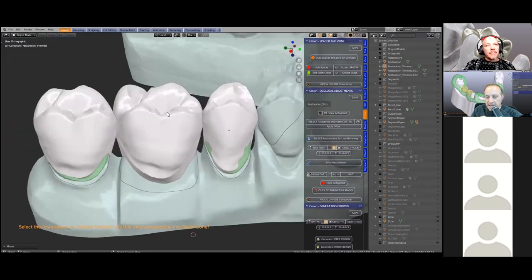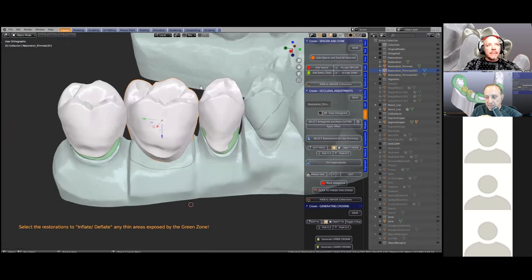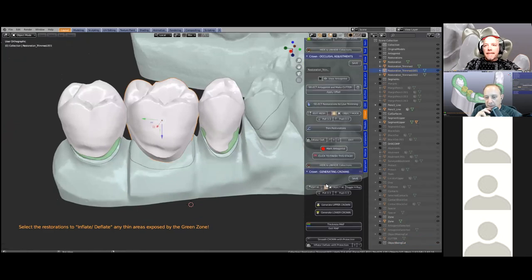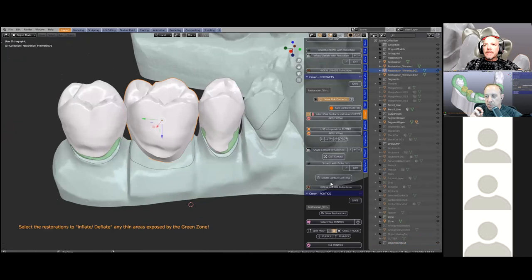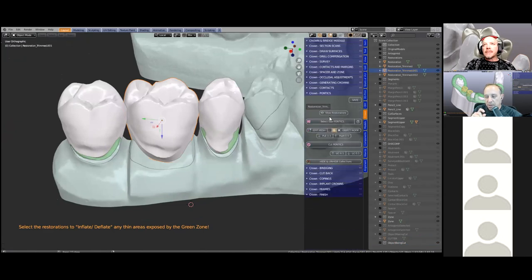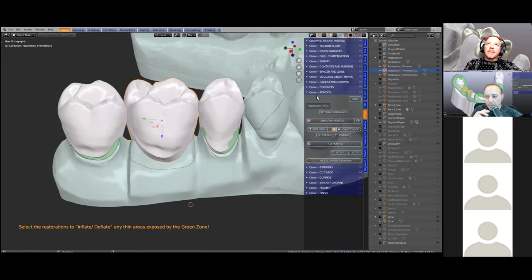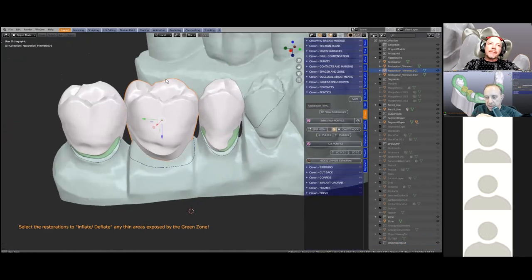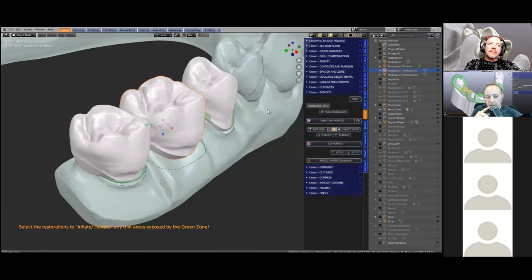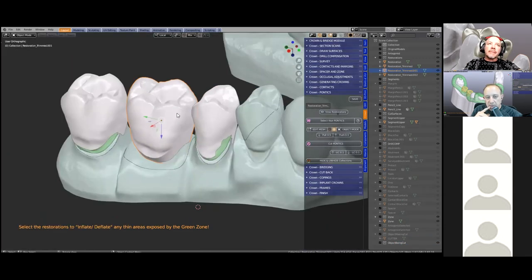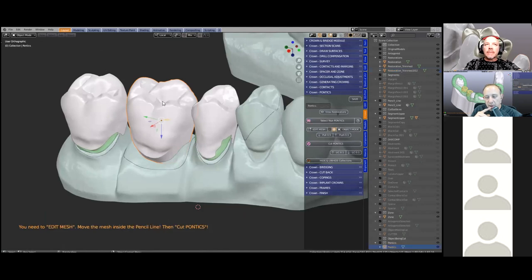This is a static cut — just the upper against the lower. If you want to do a dynamic cut, you'll need to use the articulator module, which will perform protrusive and excursive adjustment. The next step is adjusting the pontic fitting surface against the gum.